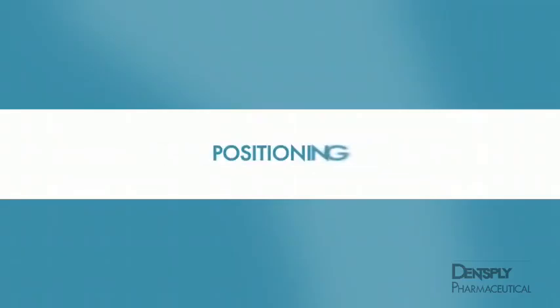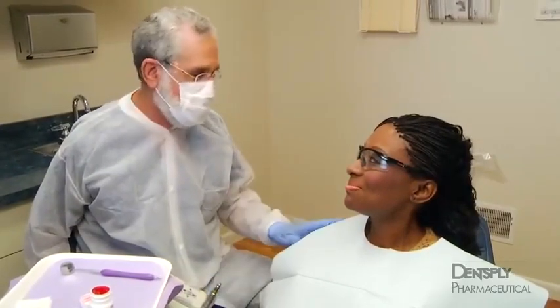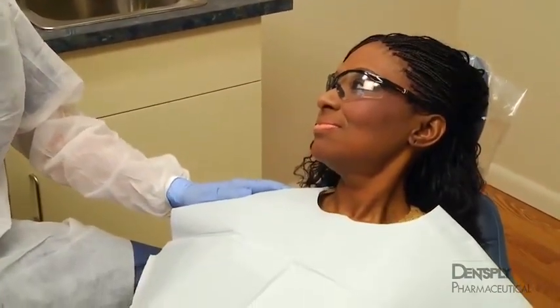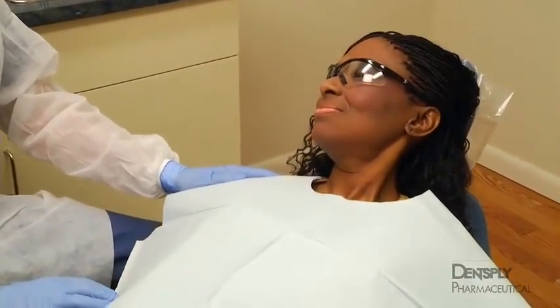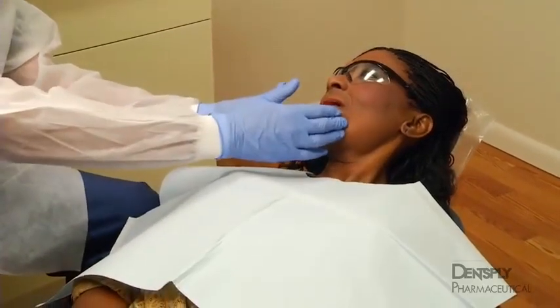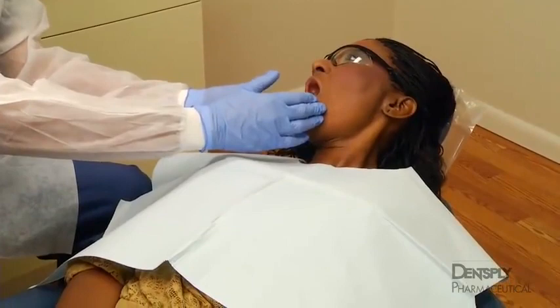Patient and operator positioning. The proper position for the dentist and patient during the administration of mandibular anesthesia is similar for all of the injection techniques reviewed in this program. The patient should be placed in the supine position, with the legs slightly elevated. This position will avoid many of the psychogenic reactions encountered during the administration of mandibular anesthesia.